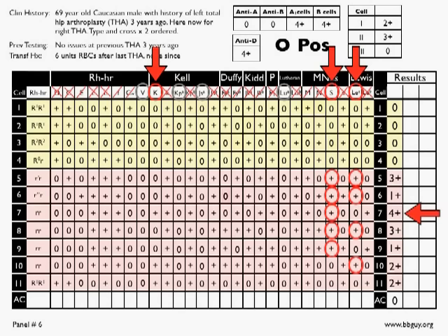You have a single dose big S in 9 with nothing for Lewis A. So a 1+, okay, maybe. A 2+ in cell 10, yeah, okay. But cell 11 is the problem for this combination, where you have nothing for either big S or Lewis A, and you have a 2+ reaction. So by themselves, anti-big S and anti-Lewis A don't really work. So let's try something else.